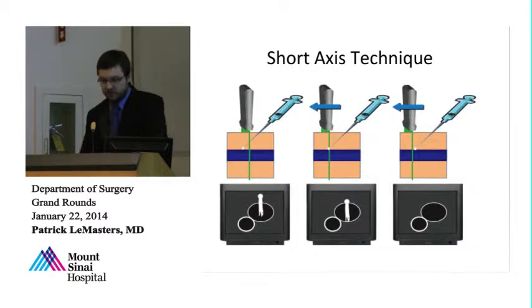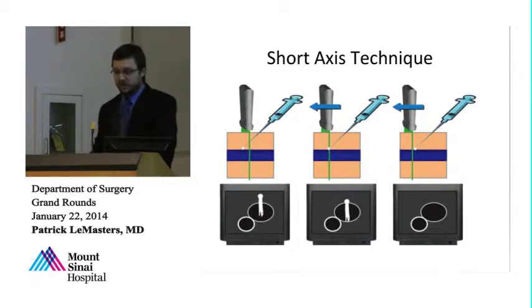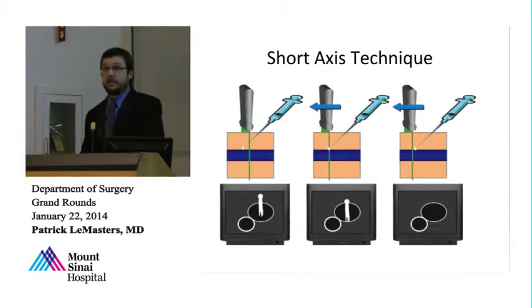So let's continue. What are the techniques that we use for ultrasound-guided access? Here I'm showing a short axis access technique. This is the technique that's probably used by most beginners. And in fact, it's the way I learned how to use ultrasound the first time, in my first month here at Mount Sinai in the SICU.